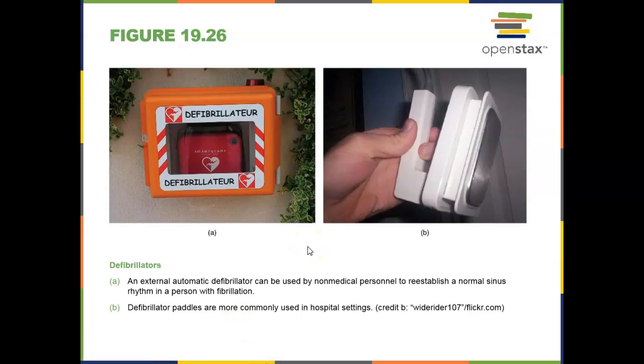So this is a defibrillator. This is what we use to shock our heart when our heart is in ventricular fibrillation. This will help to reestablish the normal sinus rhythm of the heart.